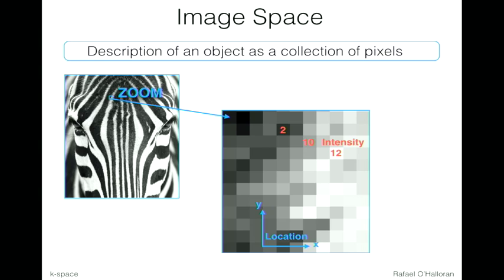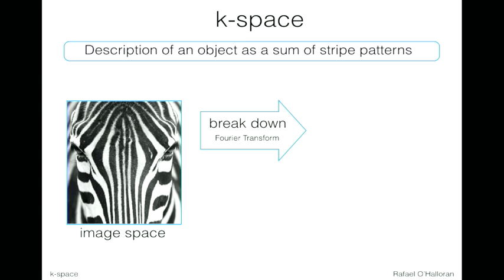And I'll just warn you that during this talk I might use the words pixels and voxels interchangeably, but when we say voxel, we mean a volume element. When we say pixel, we mean a picture element. One is 3D, one is 2D. We have to talk about things in 3D because the objects that we are interested in imaging are three-dimensional, so that's why we talk about a voxel. But if I use them interchangeably, my apologies in advance.